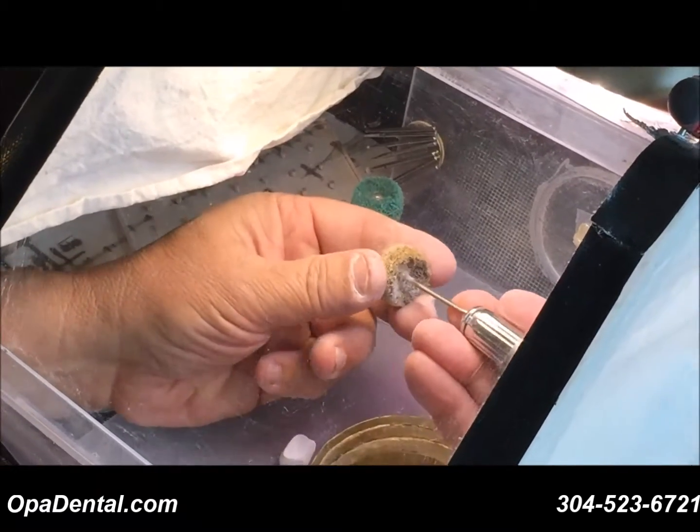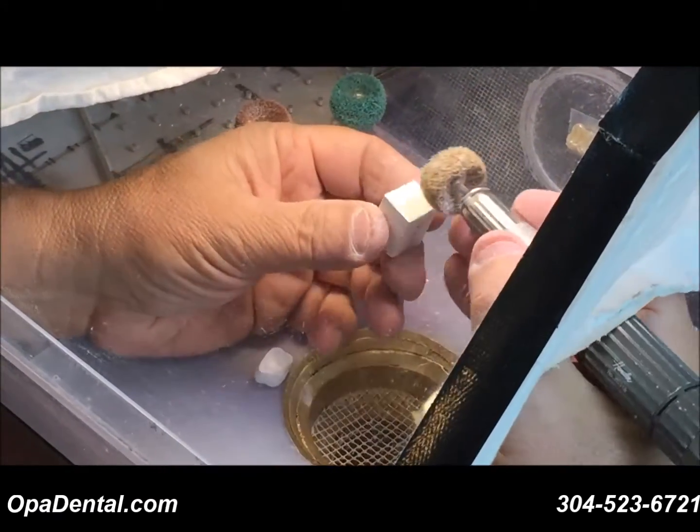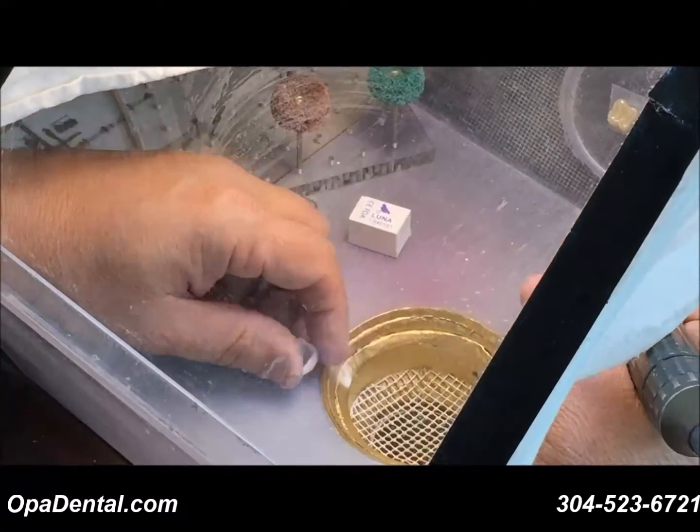I'm going to start with the coarse. I like to take a piece of old zirconia and just get the wheel ready — mainly when it's brand new — just to shape it up. Since these are new, I'm just going to show you that technique.